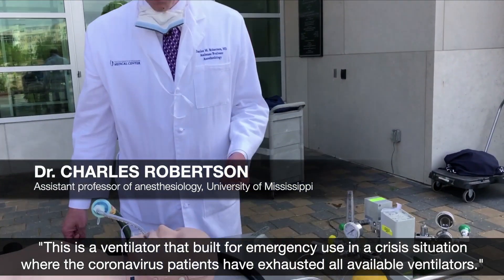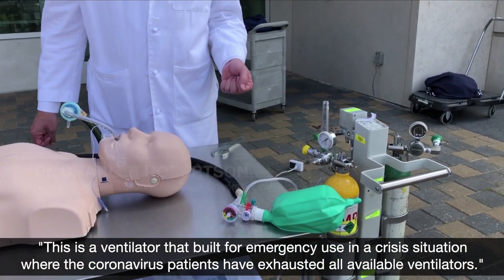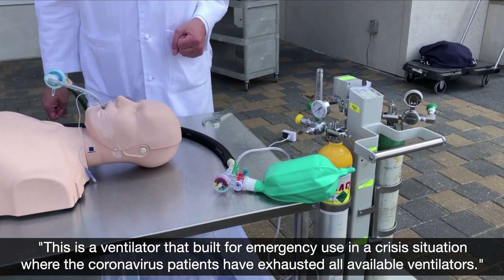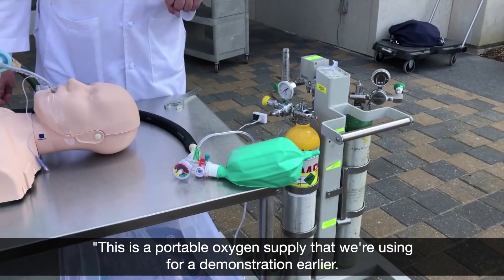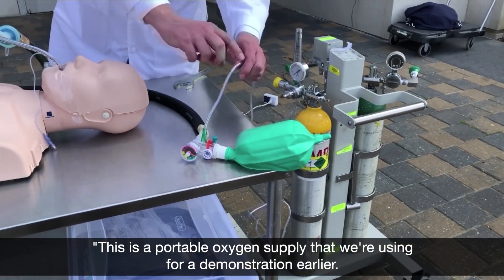This is a ventilator built for emergency use in a crisis situation where coronavirus patients have exhausted all available ventilators. This is a portable oxygen supply that we were using for demonstration earlier.